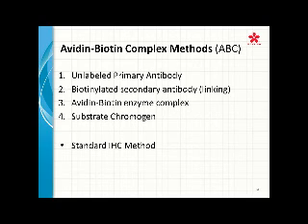However, the biotin attached with avidin can produce nonspecific staining due to the high affinity. So generally with these types of methods, you always have to have a protein blocker, because you are picking up signal on non-specific epitopes. Remember, an antibody can only bind to one epitope, so you need that one specific signal that you're looking for. If you're doing this in the clinical laboratory and you look at a slide under the scope and see non-specific staining surrounding the cells that you're trying to target, this is exactly what I'm talking about with non-specific staining.